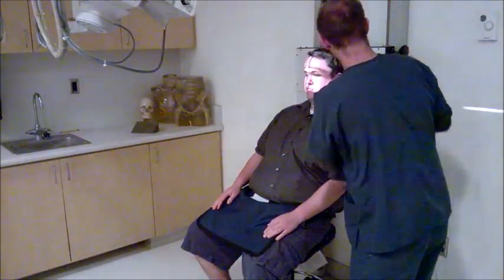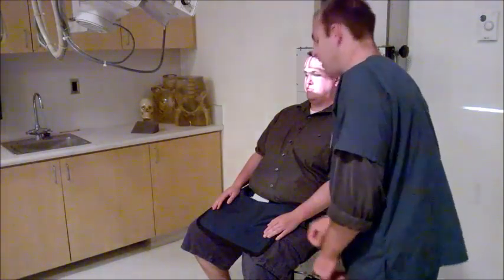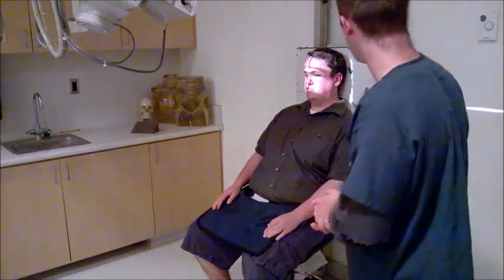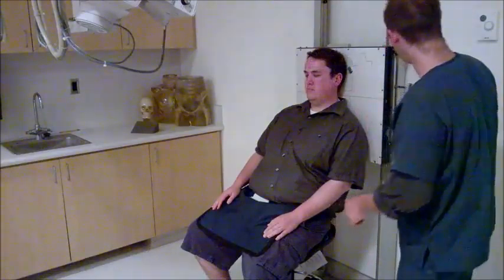All right, put my marker left side. I would go a little bit up on this technique because it's a diagonal radiograph. So I'd probably put 70 at 25. 70 kVp at 25 mAs. Okay. Of course, I would leave the room and take the radiograph, and then I would check.